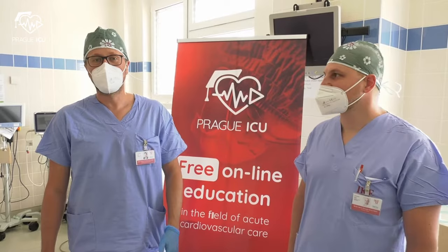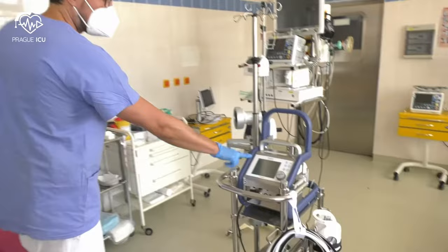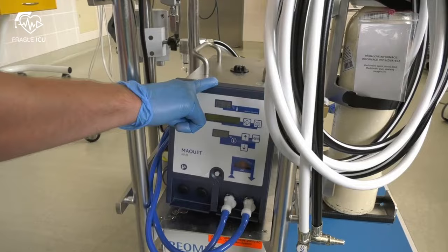Hi guys, I'm Mikhail from Prague ICU and I'm Marek from Prague ICU. Today we are going to show you how to prime the ECMO Maquet Cardiohelp machine.